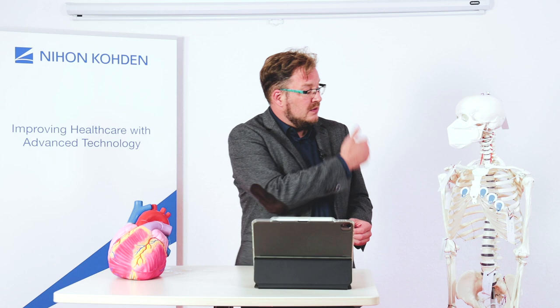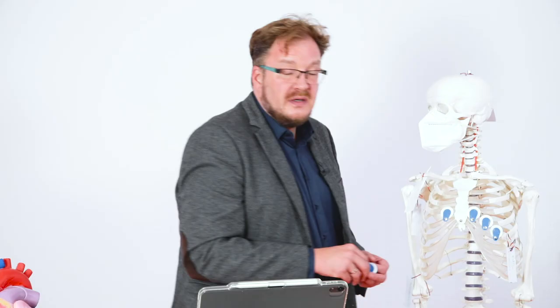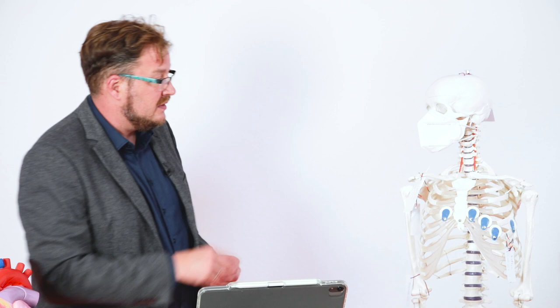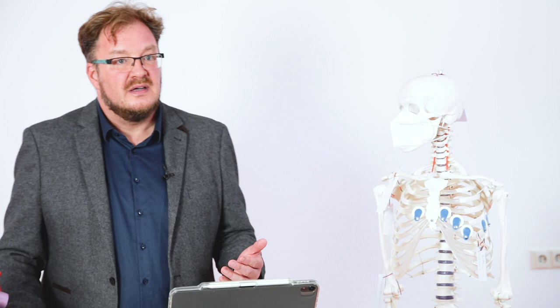Next, we look for the front axilla line at the fifth intercostal space and place the fifth chest lead there. Then we go to the mid-axilla line — I have to go around Oscar, so please lift your arm. Thank you for your cooperation, and I will place there chest lead six. Now you can see the proper placement of the chest leads, and we still need the extremity leads.